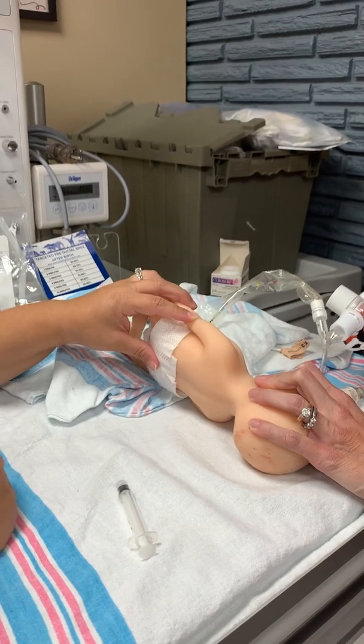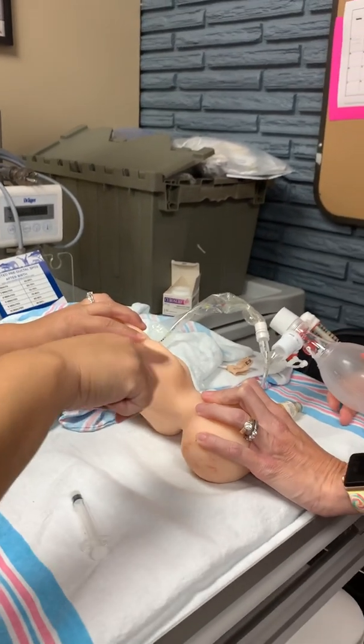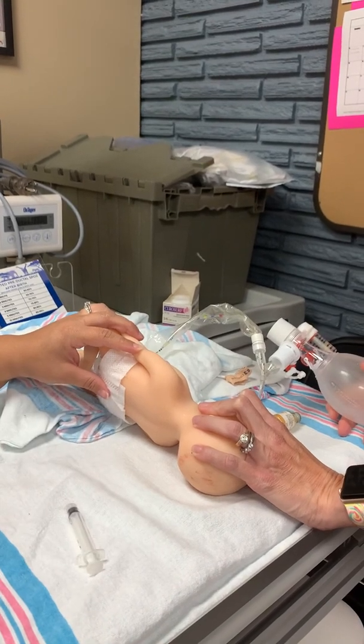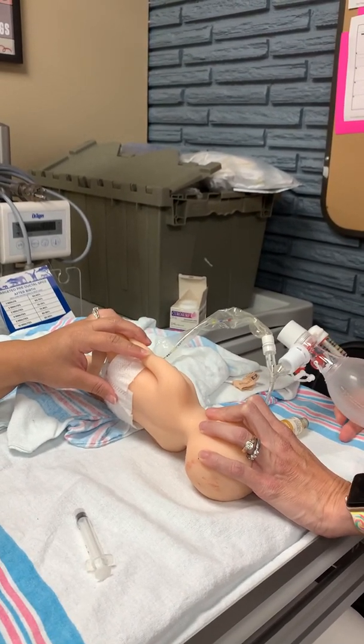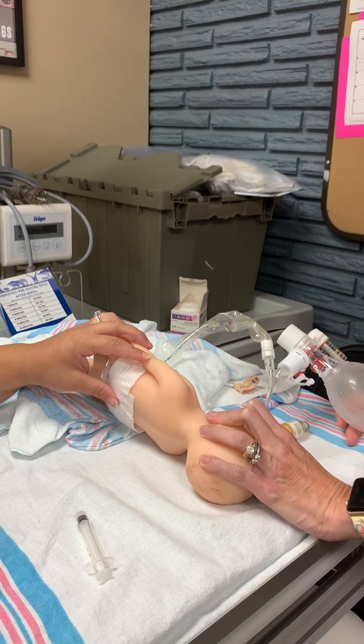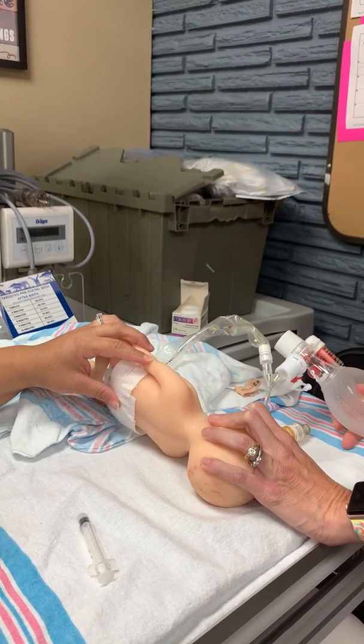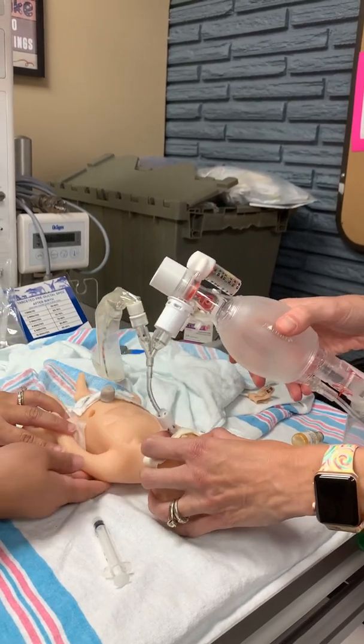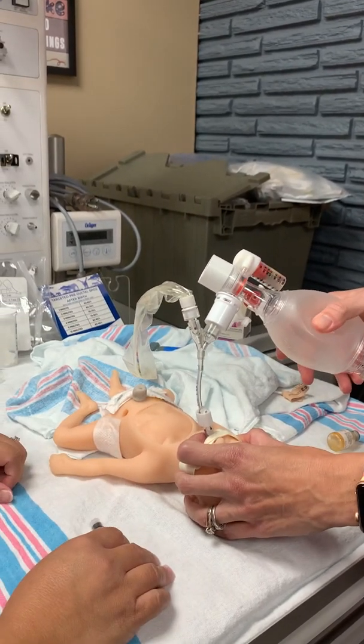So we're gonna wait until that's absorbed as well. No regurgitation in the tube. Listen to breath sounds, make sure it's all absorbed in the lungs. Make sure our baby's stable. Look at the saturations, look at the heart rate. And then after everything's been absorbed, we're going to put them back supine.